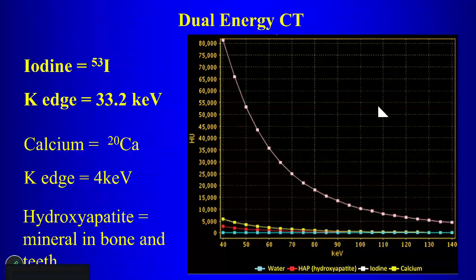And so, again, if you're using spectral CT and you're looking for contrast, you can see the attenuation changes of iodine compared to calcium and water, right? There is some for calcium, pretty much none for water, but it's the most dramatic for iodine. As you go to lower energies, the attenuation of the iodine really increases a lot.